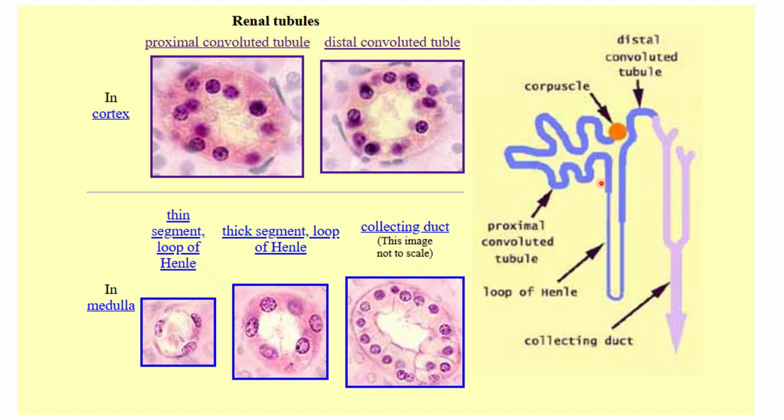So as we know, above this is the renal cortex and below this is the renal medulla. So here we can clearly distinguish this is a PCT, DCT. Similarly in the medulla also we can easily differentiate.